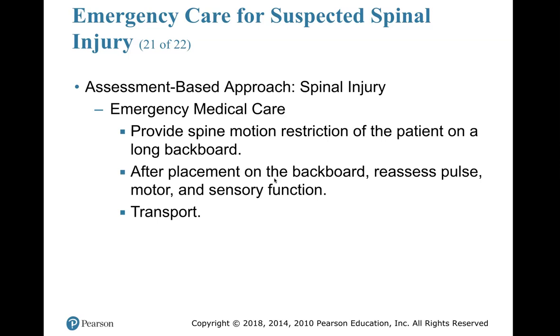If they don't have any severe spinal injuries, once you get them on the stretcher, you can unhook that scoop stretcher, and they're more comfortable on your stretcher mattress. A lot of people found themselves, even with spinal injuries, uncomfortable on long backboards on stretchers. The long backboard has become a tool for movement rather than more of a tool for immobilization. We still use it for immobilization, but you'll see that it's become more of a tool for movement in weird places. You'll see that as you do your clinicals and as you go out in the field and actually work in this job.